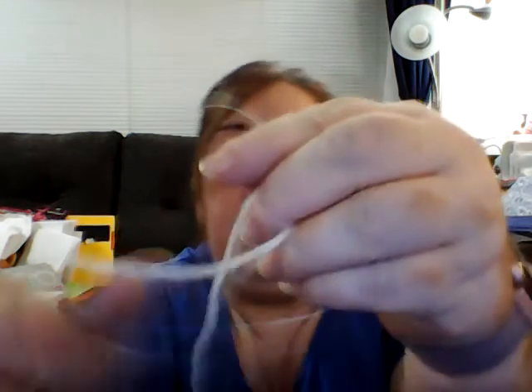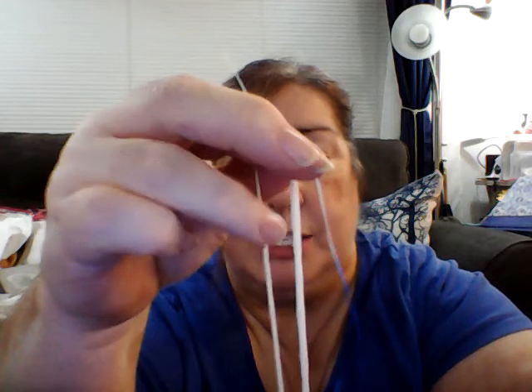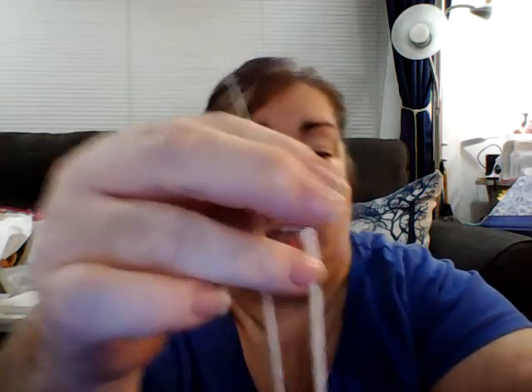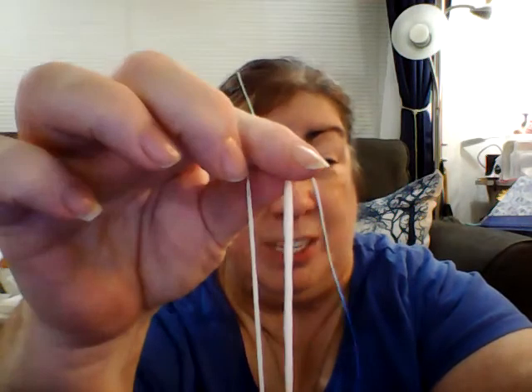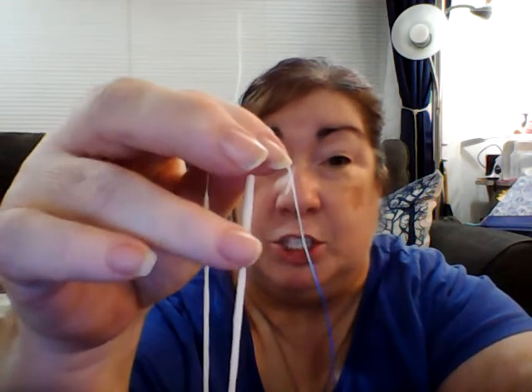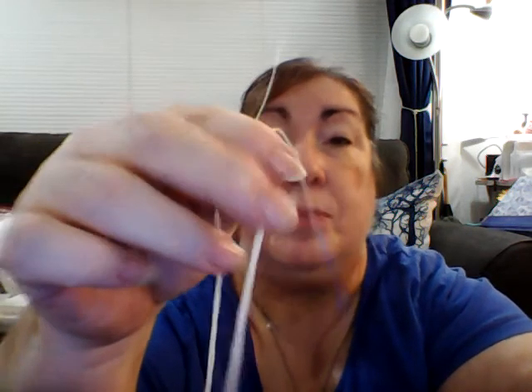But otherwise, okay, if you see, hold on. Let me put them up next to each other. Okay, so this one here is the Super Floss. This one is the Proxy Soft. See the big difference? There is no way you're getting this Proxy Soft in between your gum and your bridge for the first 2 or 3 months. You need to get this Super Floss is what you need.